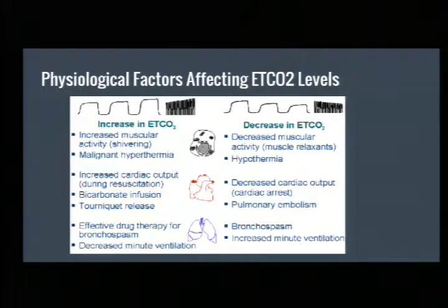So kind of think about that. If there's some big trauma patient that you've made some big change in, that might change the blood flow to lots of tissues. It may not be your actual ventilation that's changed. You give an asthmatic or COPD patient your neb, and all of a sudden you see improvement in their end tidal and decreased minute ventilation, so a slower respiratory rate.